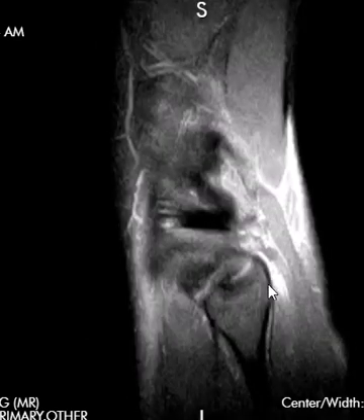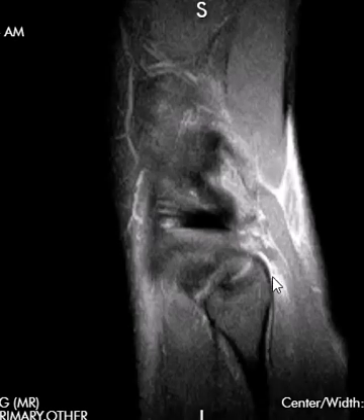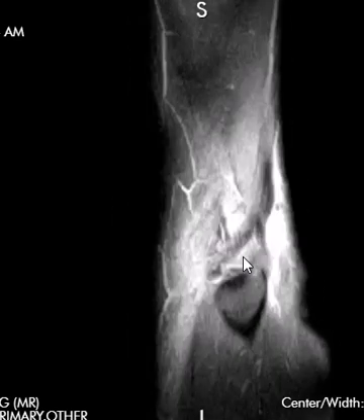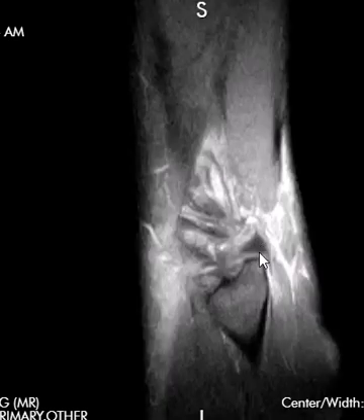Behind the fibular head, we have the soleus. The soleus muscle comes off here and attaches. There's a little triangle of brightness right here — this is part of the soleus muscle attachment, and the soleus muscle is partially torn with a little bit of fluid at the back of the fibula. Right next to that, above it on the fibular styloid, we have the conjoined tendon, which comes down and attaches. We don't see a nice attachment — instead we see gray material. This is a high-grade partial, maybe even complete tear of the conjoined tendon. We'll see the same things on the coronal view.